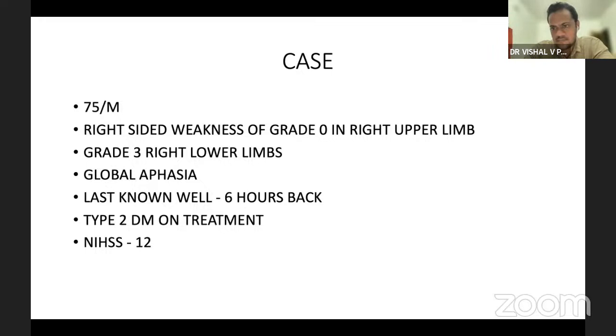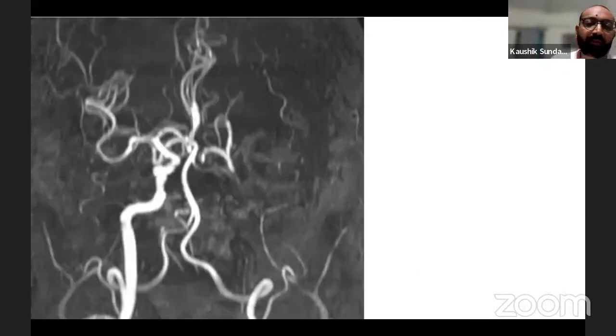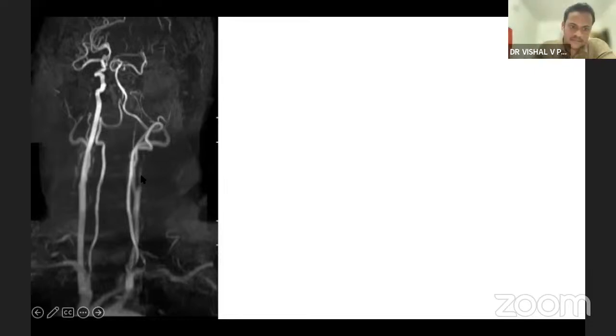There is a clot that goes from the heart, goes into the distal T. We have seen this so many times where even if there is a distal T occlusion, the carotid stops filling up from the neck. You have seen that flame shape. And if you look into your MR imaging, can you go to the MR angiogram? Next one. So you could see something faintly coming from the carotid. Correct?